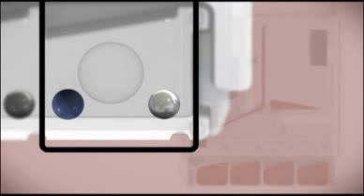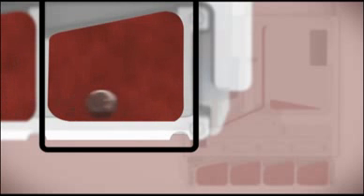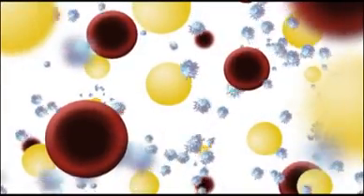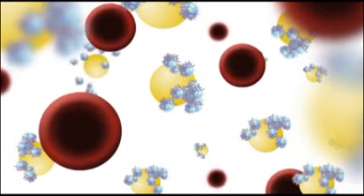The mixing ball mixes the samples while the test is running. The pellet contains fibrinogen-coated beads and an agonist that serves to activate the platelets and facilitate aggregation. As the heated sample comes into contact with the pellets in the individual mixing chambers, the pellets dissolve immediately. Simultaneously, the mixing ball starts to mix the solution. As the sample is mixing, platelets begin to activate and bind to the fibrinogen, creating aggregates.